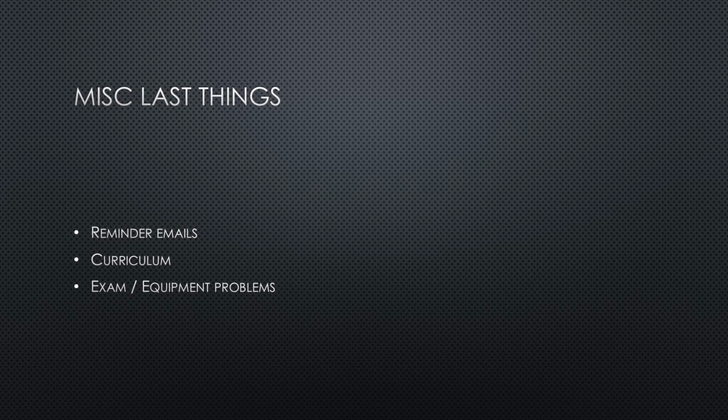This is something I mentioned in the syllabi, but if there is an issue, you need to contact me, right? This could be an issue with the equipment, in which case it probably needs a phone call. Like either the ultrasound is damaged or non-functioning or something, and we tried rebooting it already, powering it off and back on, and that didn't work, and there's still problems, then that probably deserves a phone call. Clinically, I work nights, but if you call me multiple times, I usually wake up.